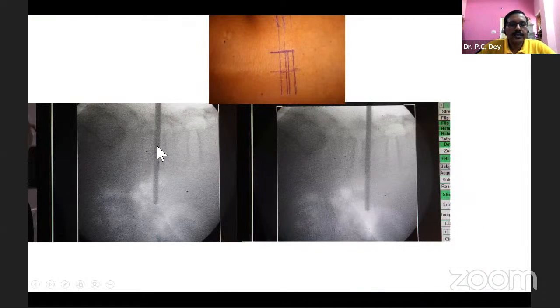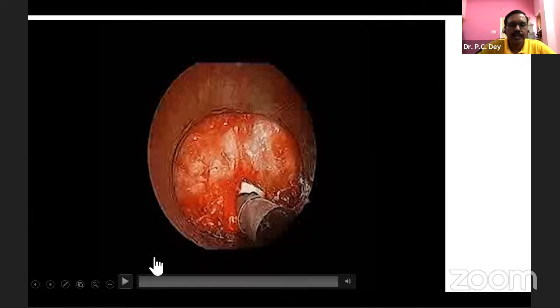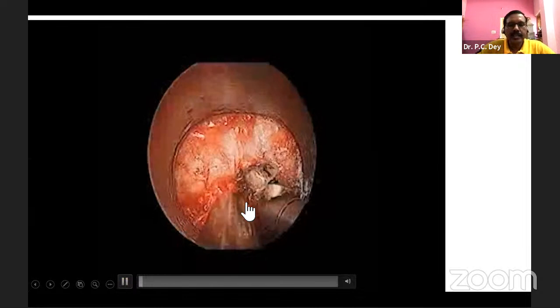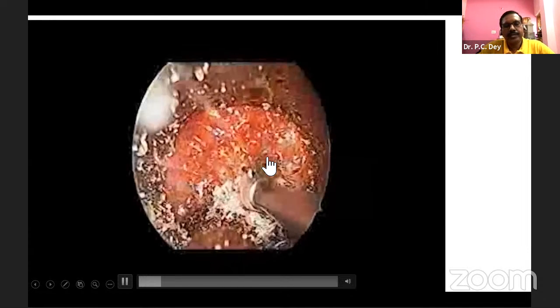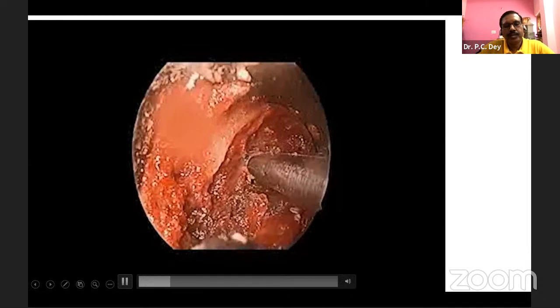And this is the regular. We are marking, giving the localization, but you have to go a little bit above, that is 5 to 10 millimeter on the foramen. This is the regular marking of the interlaminar space, but this is the foraminal approach, a little above, 5 to 10 millimeter, and then target the isthmus or target the lateral aspect of the inferior articular process of the facet.